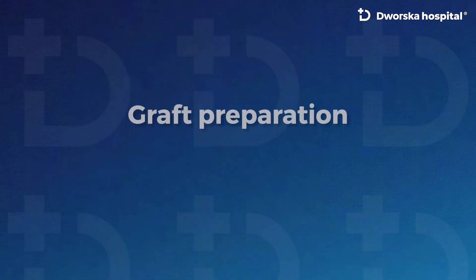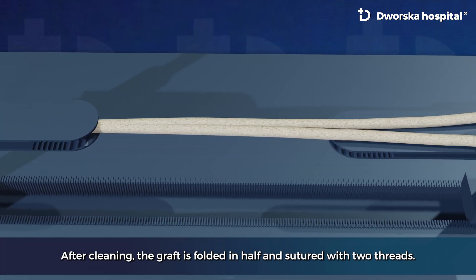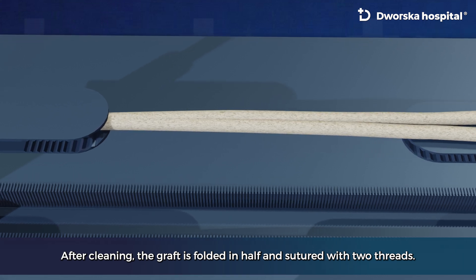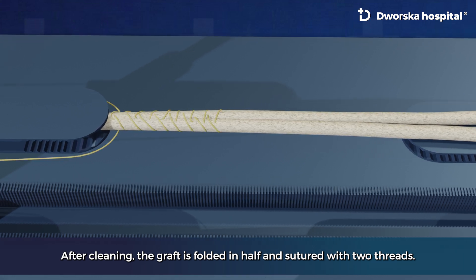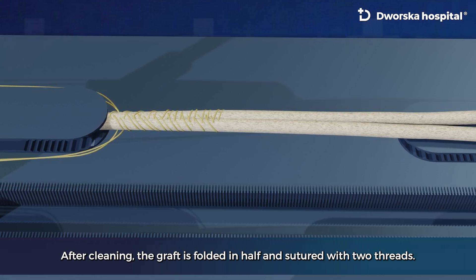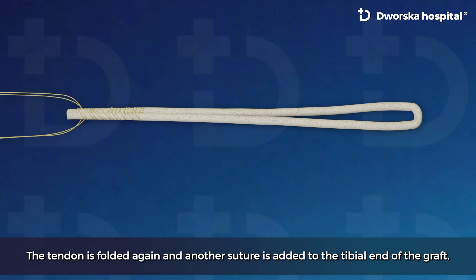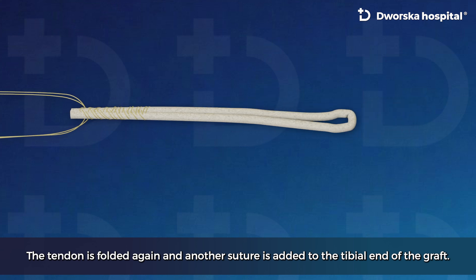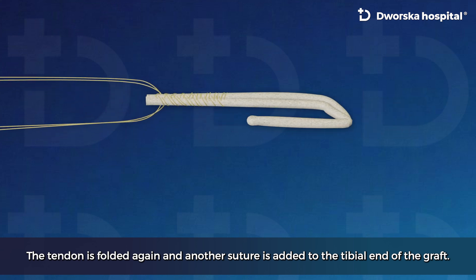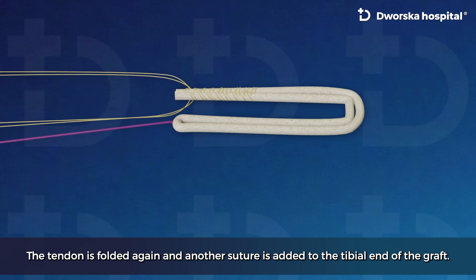Graft preparation. After cleaning, the graft is folded in half and sutured with two threads. The tendon is folded again and another suture is added to the tibial end of the graft.